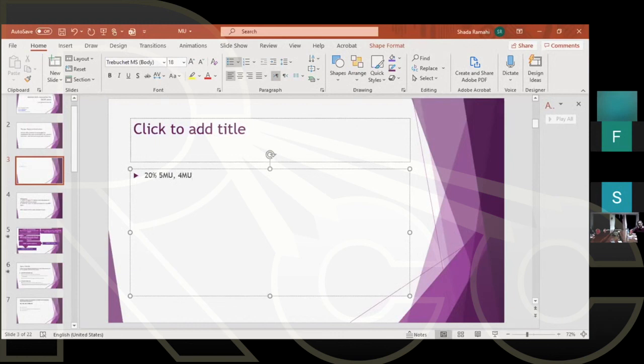And as Sara said, this comes when you have field-in-field, because sometimes your field-in-field is only giving 5 or 10 MUs. Even if I say 10 MU, I have the third subfield giving me 10 MU, but the second check is calculating 9 MU. Then the discrepancy here is 10%. In this case, this is important. In this case, guys, the percentage is not real.